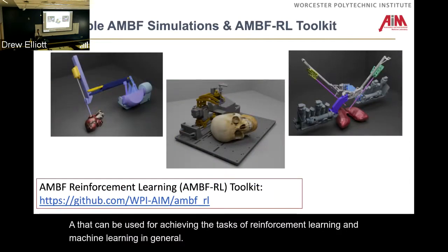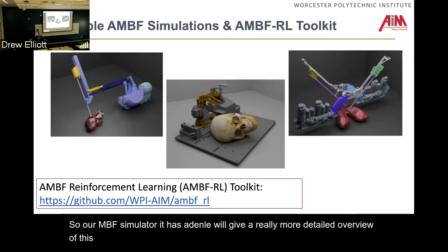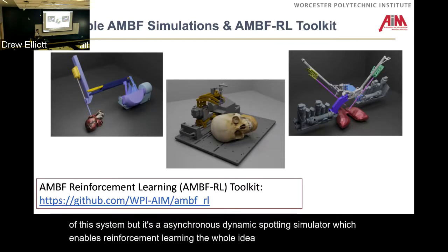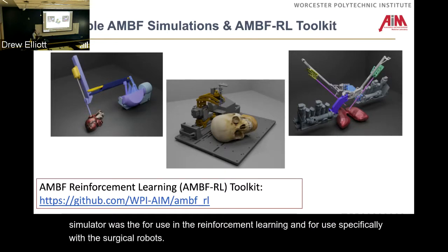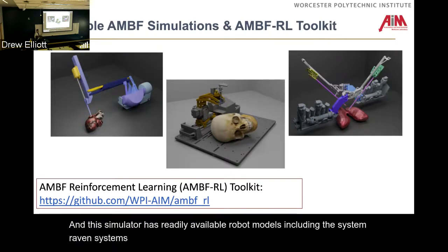So our AMBF simulator, Adnan will give a more detailed overview of the system, is an asynchronous multi-body simulator which enables reinforcement learning. The whole idea behind developing this simulator was for use in reinforcement learning, specifically with surgical robots. This simulator has readily available robot models, including the DVRK system, Raven systems, and also the KUKA LBR and LBR Med.